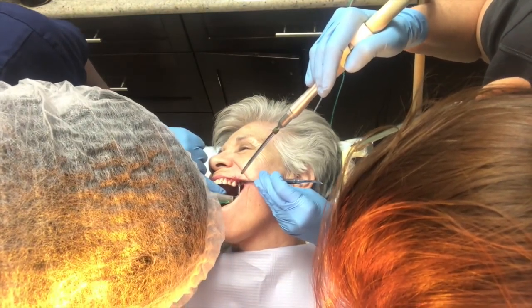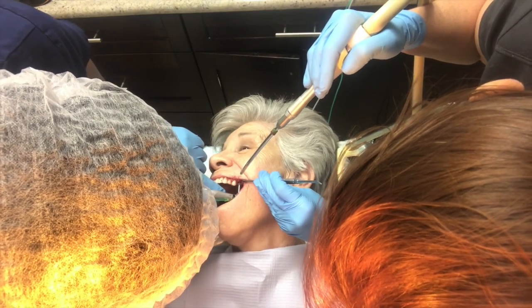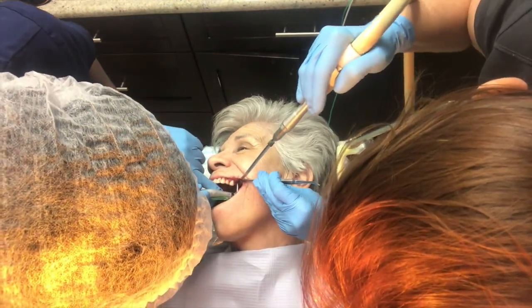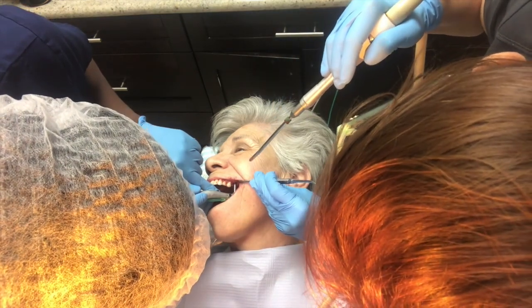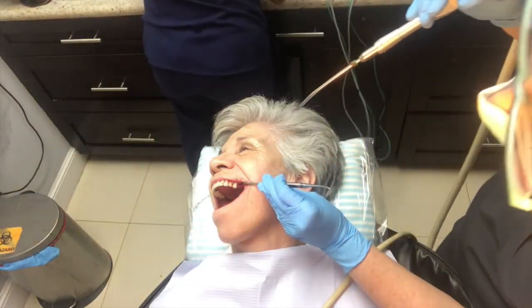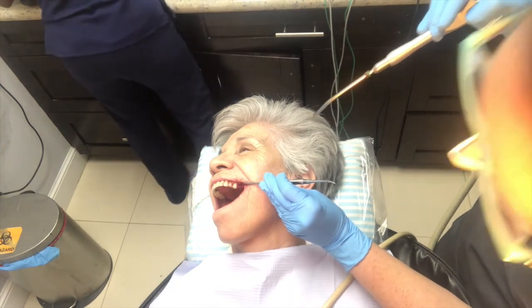When I'm placing the implants, we're at about 35, and also a torque, which is the strength that it takes to place the implant. She's feeling absolutely no pain right now. Maybe she'll feel some vibration and rotation as the implant goes in. And what I do when I place the implant is I'll put it in initially with the drill. And the next thing that I'll do is get a torque wrench. Yes, it is called a torque wrench.